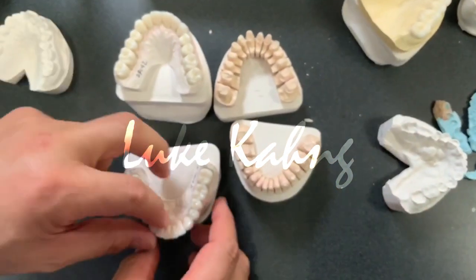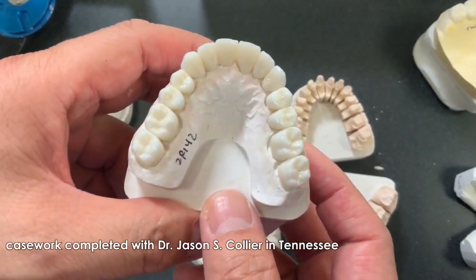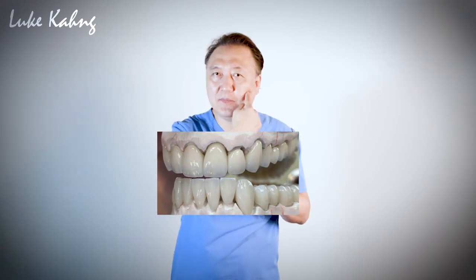And then this one is the final restorations that I have to share with you guys. And here is top and bottom, the lower. The full mouth cases are very imperative. It's not like the cookie cutter, not like the easy job like this, right? So meaning the top and bottom.